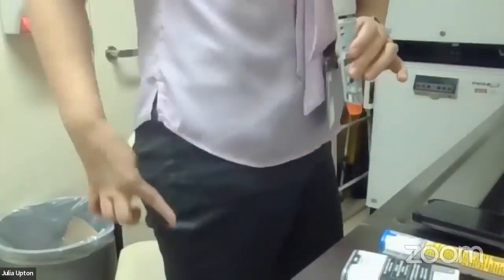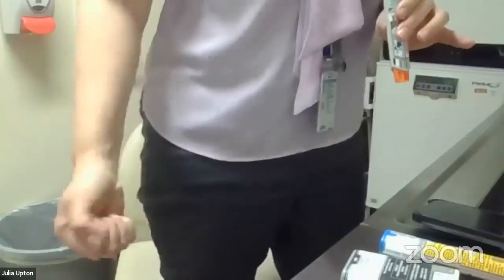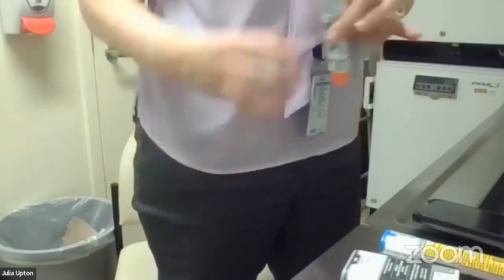Okay, so if I needed to give this, then again, speaking of the position, ideally I'd be lying down, and then I would take this off with 2 fingers straight up. So straight up. Now the back is off. And then it's the upper outer part of the thigh. So I'll just tip this down a bit. So, here's the seam. I'm in front of the seam. My arm kind of pretty much naturally falls here in like the meaty part of my thigh.